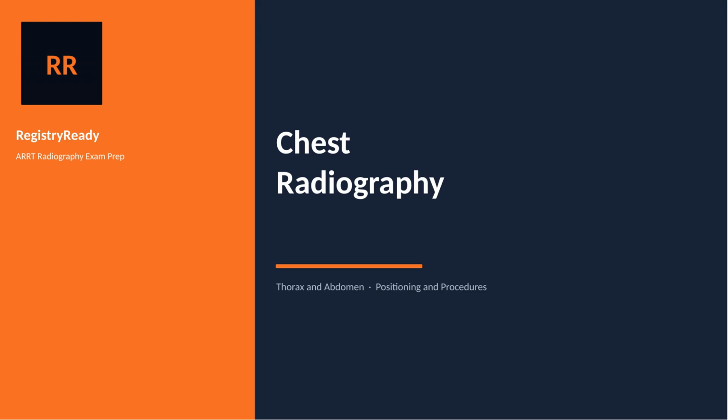Positioning Lesson 1 is chest radiography, the most commonly performed radiographic examination in medicine. You will take thousands of chest x-rays in your career. The standard is a PA and lateral. Every positioning decision you make, where you center, how you instruct the patient to breathe, which AEC chambers you select, directly affects whether the image is diagnostic. 14 minutes. Let's build this from the beginning.